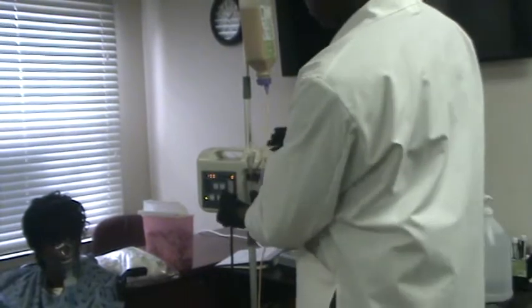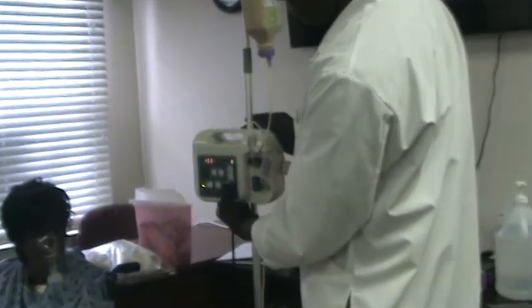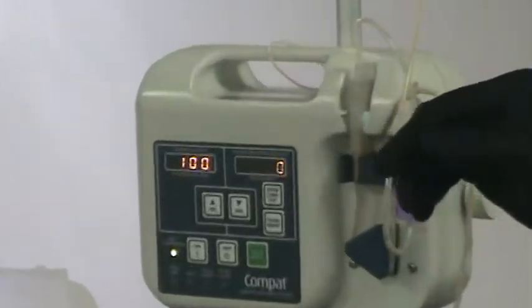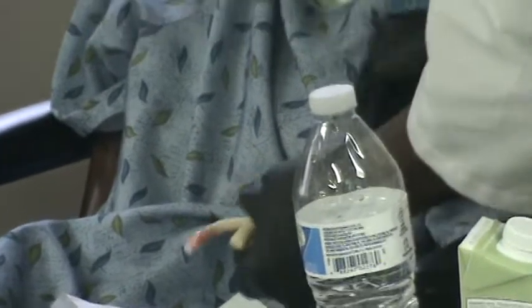You're going to put the feeding on hold. It's on hold now. Disconnect. You're going to then disconnect the feeding. Close it. You can put this here. There's a hole in the back of the machine to hold that. Or you can just hang it like this. And then give your medicine or flush.